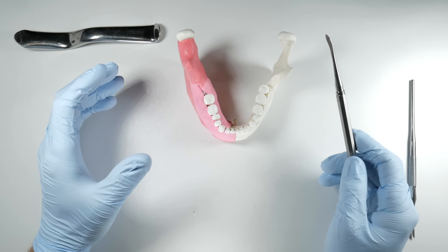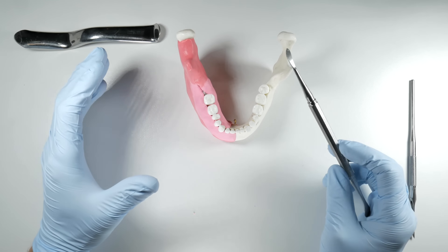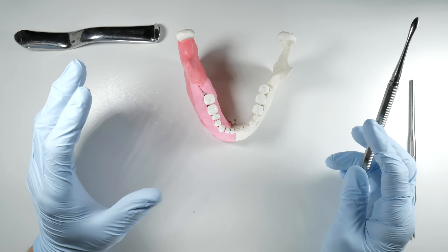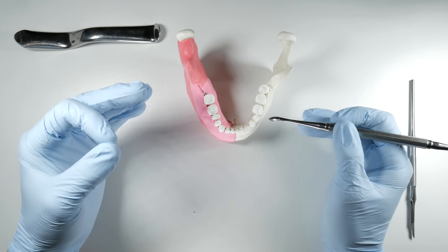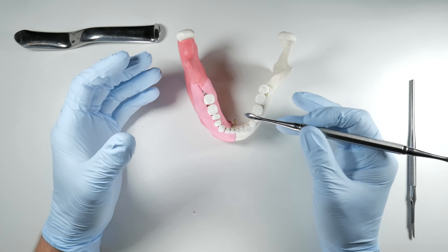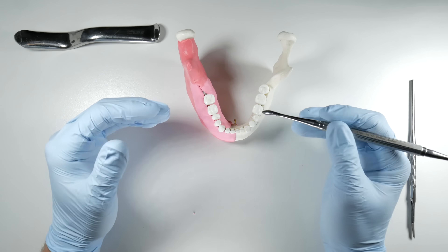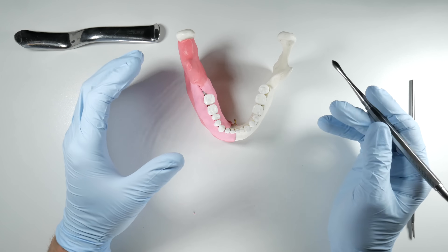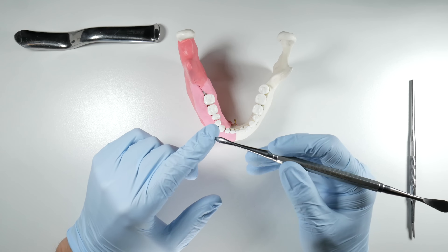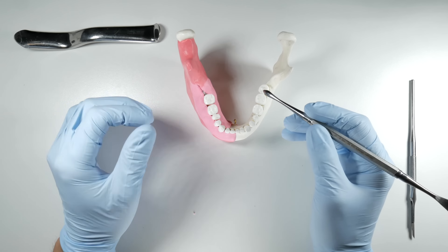Sharpen your periosteals if you need to. If you've got old ones, probably the best thing to do is just throw them out and get brand new ones, because working with a dull periosteal is like trying to use a spoon to get the tissues off the bone — you're going to tear them and have a tough time getting your flaps open. Have a sharp periosteal with a sharp tip; when you poke yourself it should feel a little bit uncomfortable.